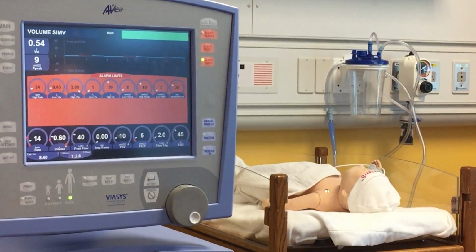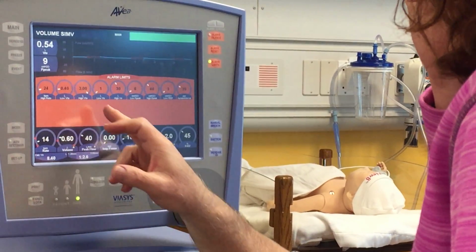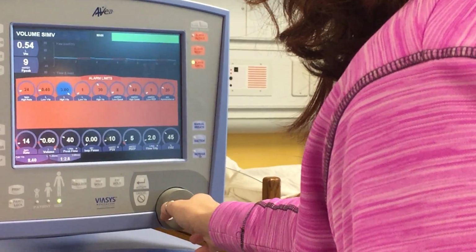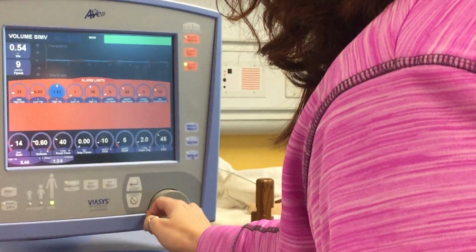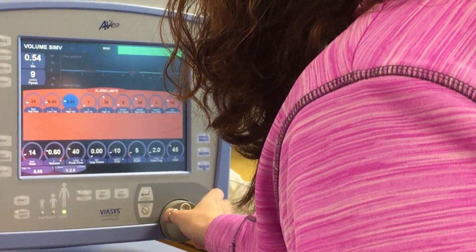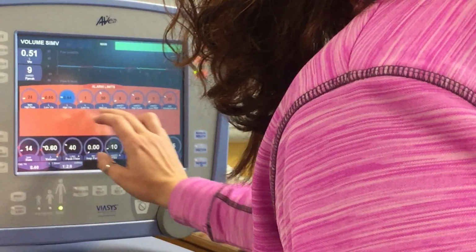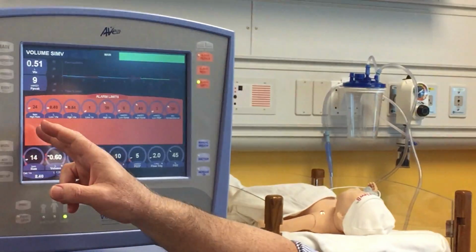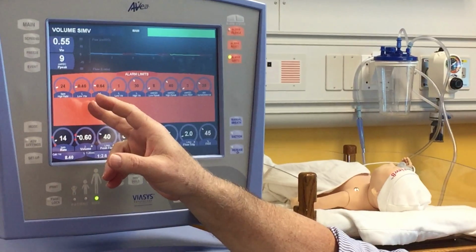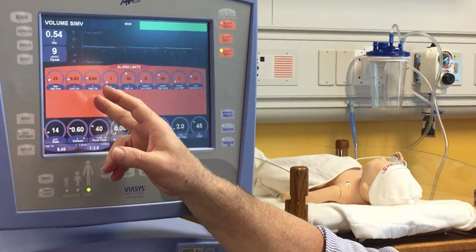High is you go 100 above. So what's our high VTE going to be set at? About 600? 640? Okay, so we got our high rate set. We got our low tidal volume set. We have our high tidal volume set.